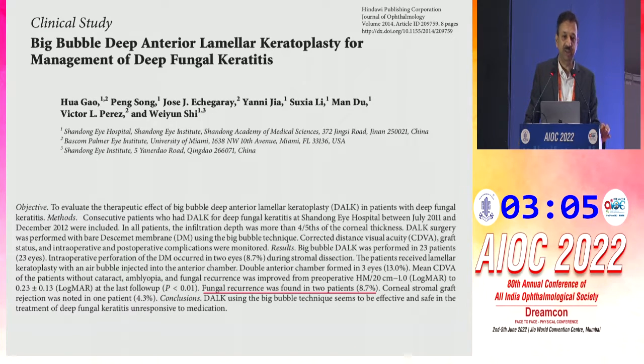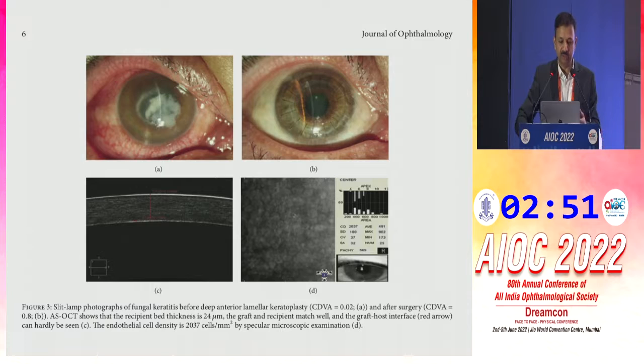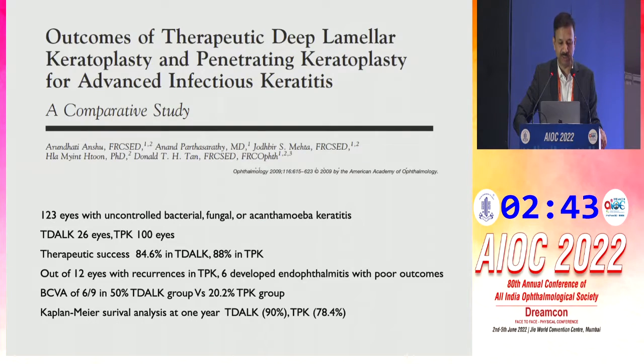And in our experience of treating fungal keratitis, we see a much higher volume of fungal keratitis than what they see in the West, and we have been able to medically manage them quite well. So I think we tend to persist with medical therapy for a longer duration of time. So this is one of the photographs from the publication showing the central fungal keratitis, which was managed successfully using lamellar keratoplasty.